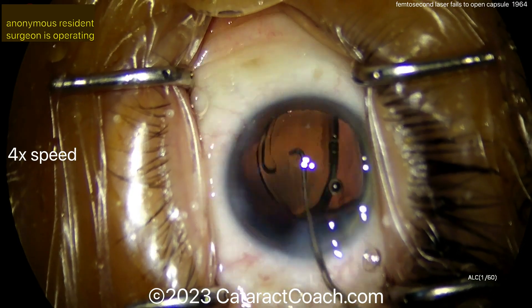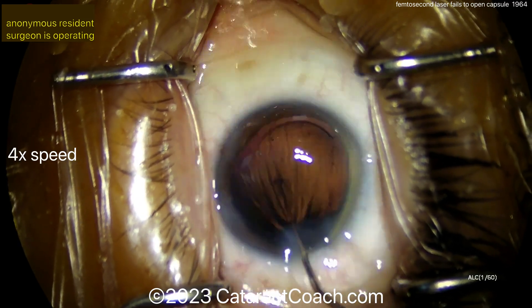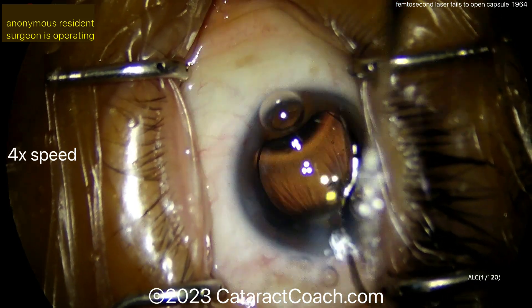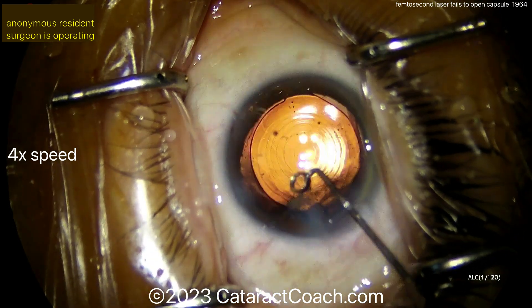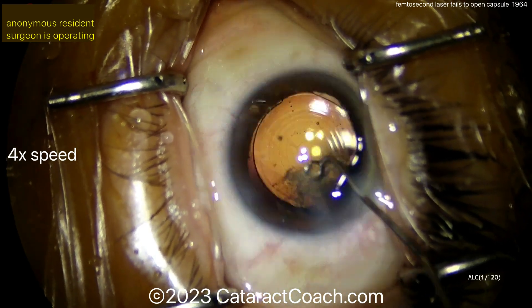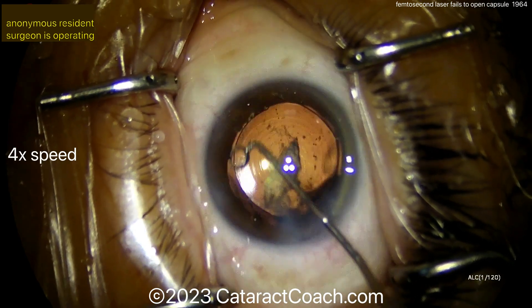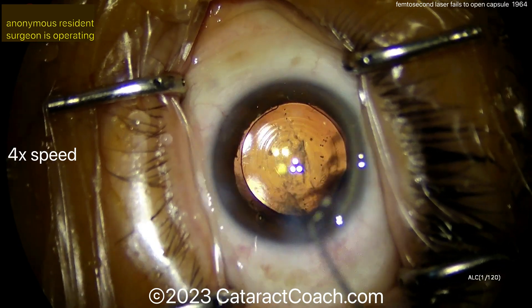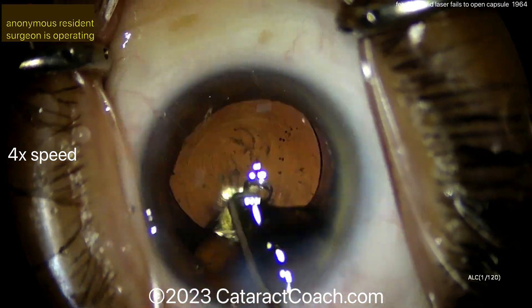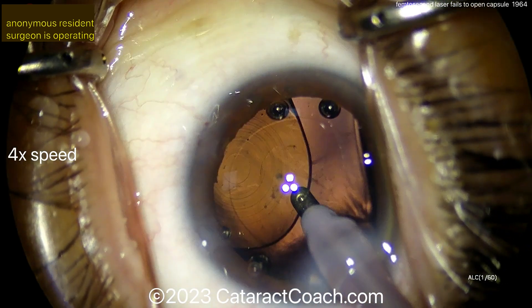Here comes the lens — looks like a single-piece acrylic, trifocal design. Get that into the capsular bag and let's see the rhexis size — looks pretty good. Rotating the lens to help free up that lens material and cortex is a good move; just be gentle. The capsular polisher is also being used to help free up that big piece of sub-incisional cortex — glad you got that out, good job. I would be very cautious on capsule polishing here; err on the side of conservative judgment. The rhexis size looks great — a beautiful case.